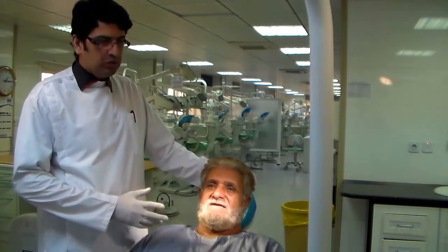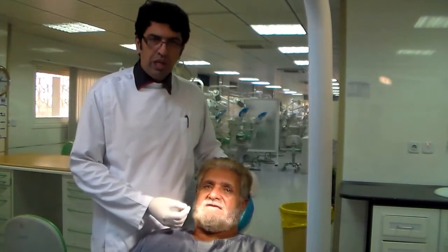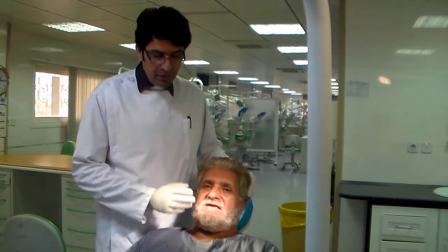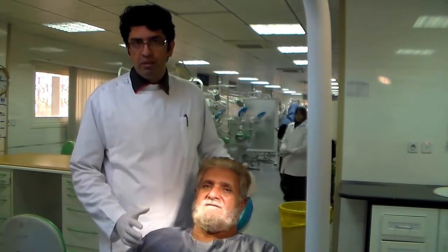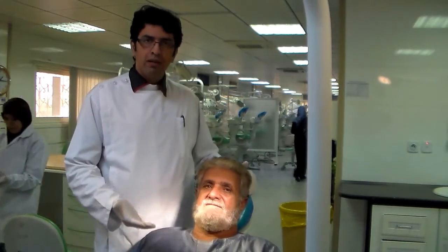When you want to look into the mouth and observe certain things like landmarks or check for the tray, you can put the chair in any position that is convenient for you to see. But when it comes to making the impression, you need the head to be in a particular position for the maxilla and for the mandible. Essentially, you want the maxilla and the mandible to be parallel to the floor.